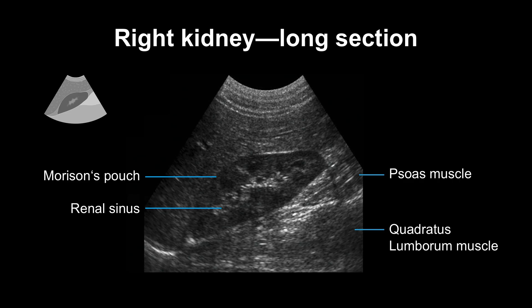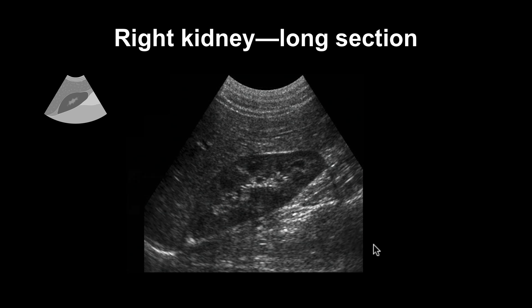Here it is on ultrasound. We see the thin echogenic line between the dorsal border of the right liver lobe and the right kidney forming the Morrison's pouch. We see the echogenic renal sinus here, and the psoas and quadratus lumborum muscles.